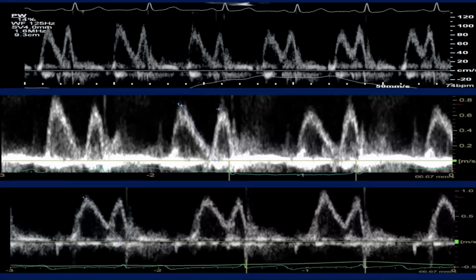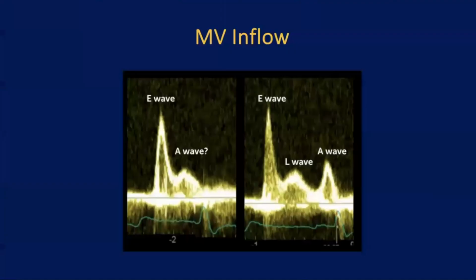And those patients, for me, I will pay more attention to their diastolic parameters than, for example, the other patients who have steady and continuous flow. All these are really nice inflows that we're taking here in our lab, and I always keep them as memories. So L wave, I think we have presented many times. It's always confusing, truly, as if it's alone, it looks like an A wave.